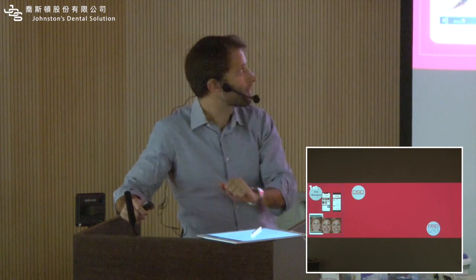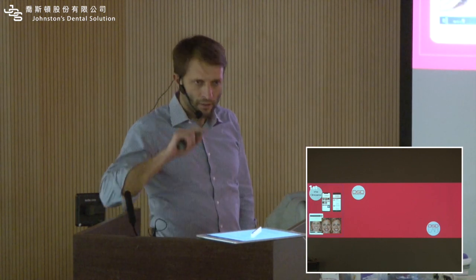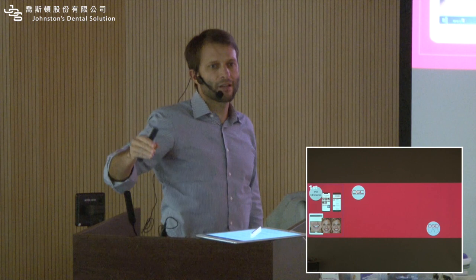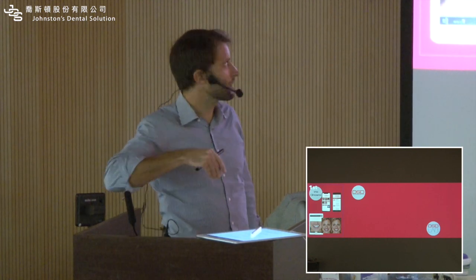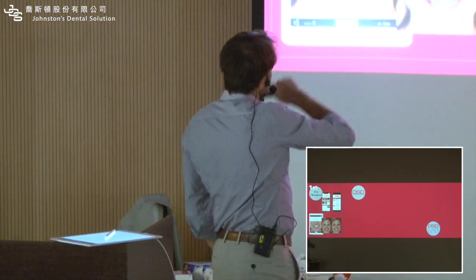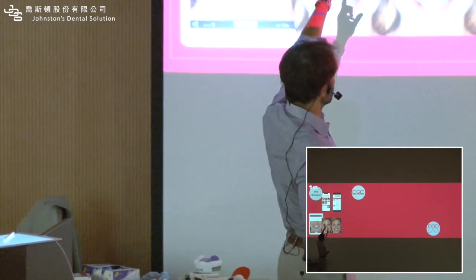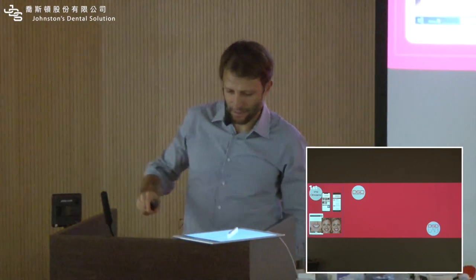As you enter the app, you're going to click on new case, you're going to click on patient documentation, and the app will teach your team on what type of images we need, okay? So you're going to put the 5 pictures, you're going to do the STL, so the app will bring everything together, and then you're going to have a link to what we call the DSD Planning Center.